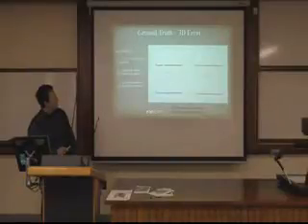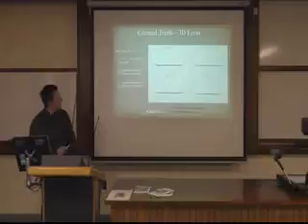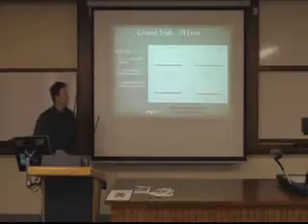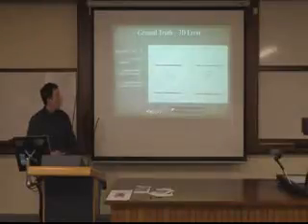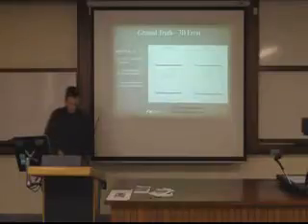This is for tracking 4 fiducial markers as the gantry rotates. And this is the typical kind of convergence that you'll see when the Kalman filter is building up its accurate description of the noise covariance matrix. You can see very little deviation there. So that established a ground truth, and we could say that this method was precise. It produced a root mean square error of approximately 0.17. And, by the way, all the detections to reconstruct the 3D locations of 4 markers took about 20 milliseconds. So it was very fast.